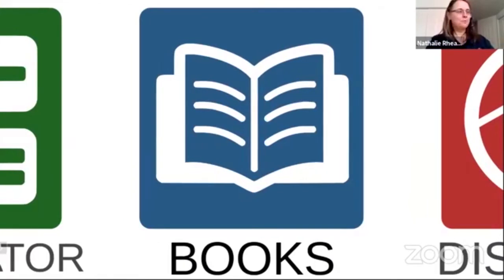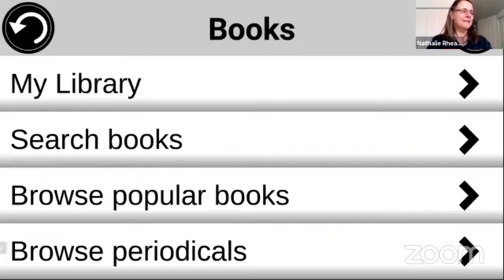If you go on the book share, you have access to books. I just want to show you how it works. The screen you will be seeing is my Connect 12, so I am moving on a Connect 12 for you to see. You can stop me anywhere. This is not a recording. I can stop and explain what I did, and rerun those examples.